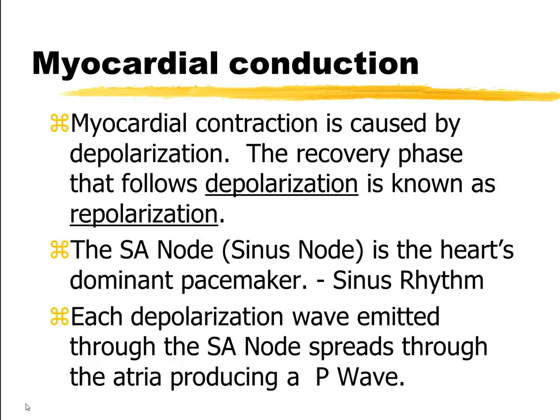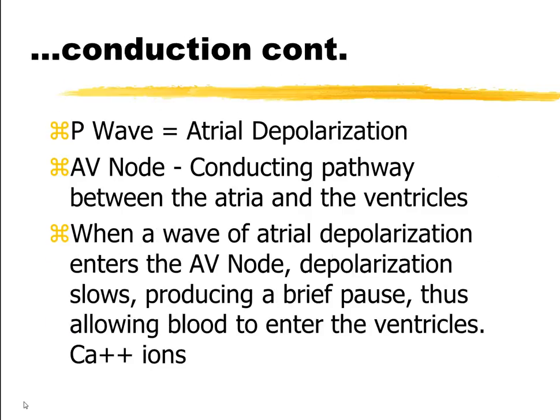And we'll show that on the ECG strips in a later video. Beginning, we're just going to look at these as we go. But remember that first little bump you're going to see on the ECG strip is the wave going from the SA node to the AV node. That is the P wave, or atrial depolarization. We hope that's happening. It doesn't mean that it for sure is, but with that movement of electrical activity through the atria, it's going to show up that P wave.